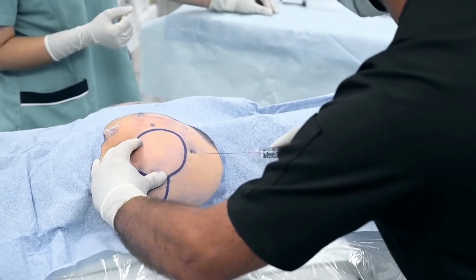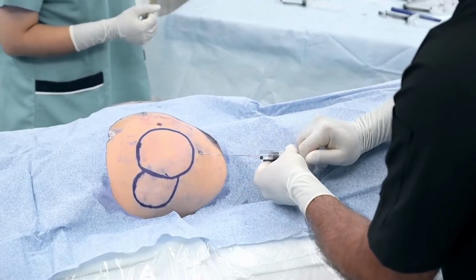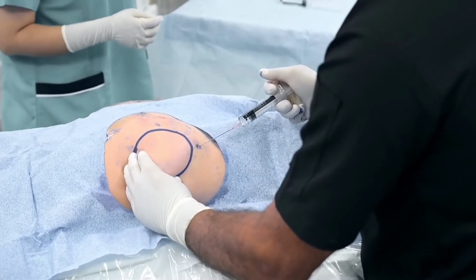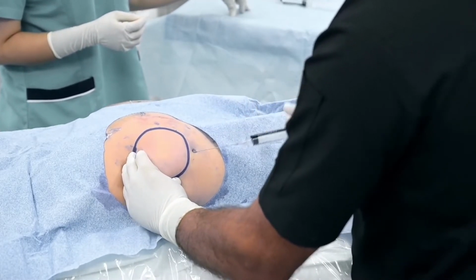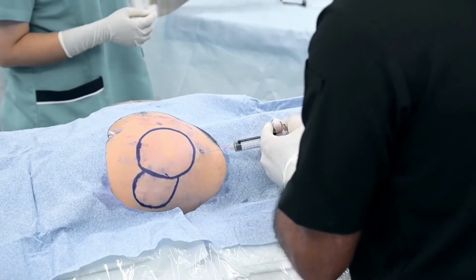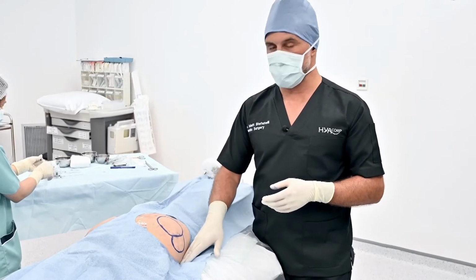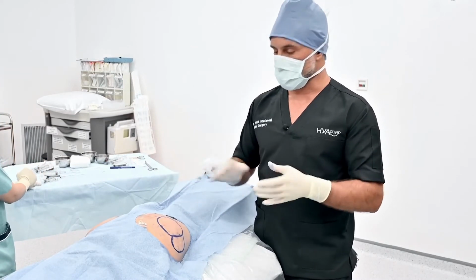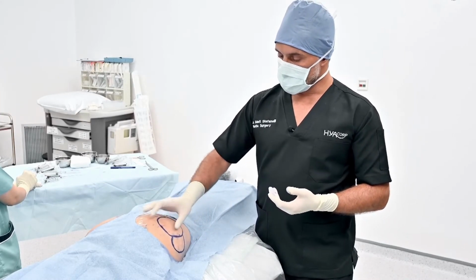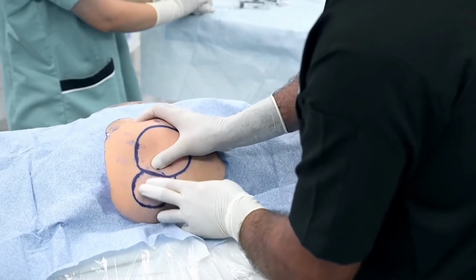And I also like to come back a little bit in my lateral butt to make some crisscross injection. Okay, I like to check the patient in a standing up position. This is very important, to always keep 1 or 2 syringes each side because we might have some bad surprise. The result might look good now, but when she stands up, maybe there is a little bit of defect here or here or here. Before doing that, let's massage a little bit.